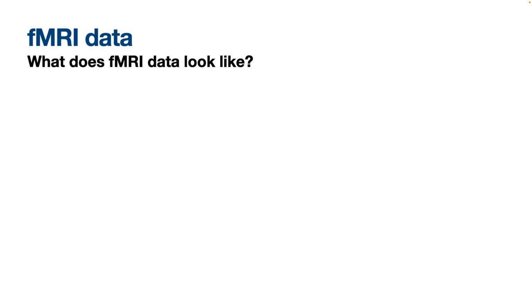In terms of fMRI, what you do is you acquire this 3D box, but you acquire it not every 6 minutes, you actually accelerate what you're scanning. You try to do this every 1 to 2 seconds, so you get these snapshots every second, more or less, ballpark. It depends how fine the detail is that you're interested in, how strong the scanner's field is, that sort of thing. So it's not 6 minutes, it's like 300 times faster than that.